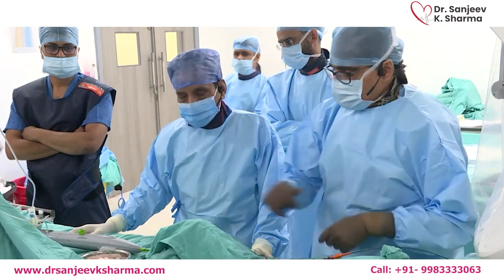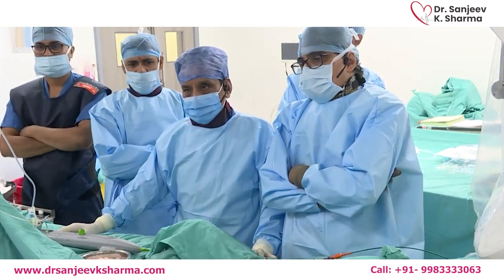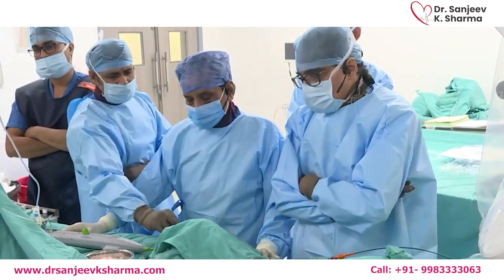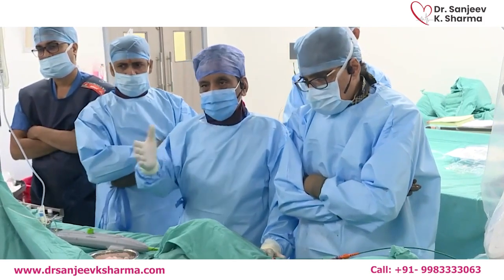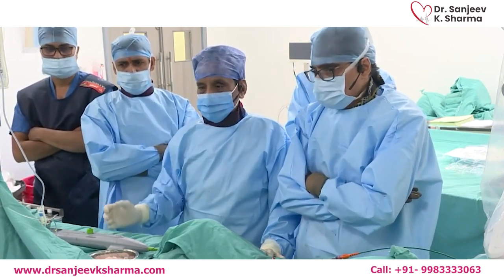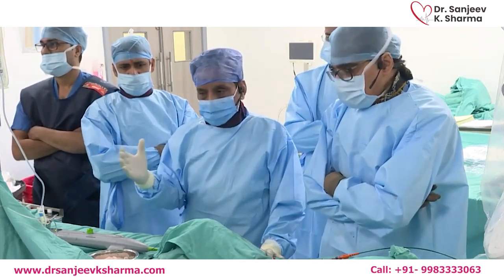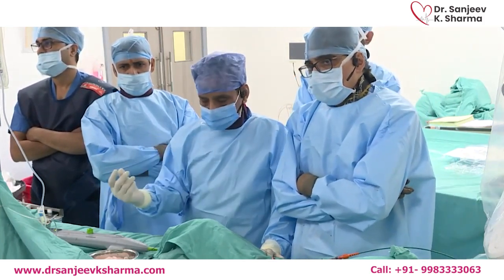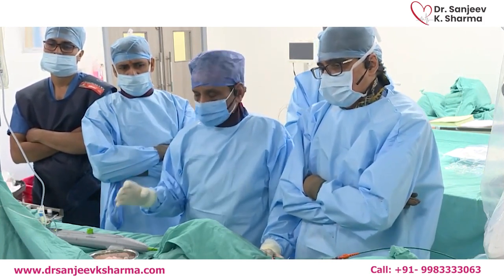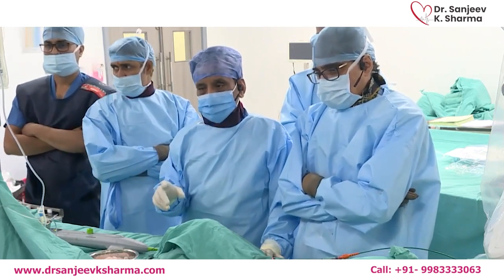I know that a lot of talk happened about IVUS versus OCT. Until we have a better agent that will not affect the kidneys, one of the big dichotomies is that anybody with a high creatinine like this particular patient, with a GFR less than 40, will go with IVUS. Some people say you can do a little injection with a guideliner and then put an OCT through it, but still some contrast will be used. So in this case, we decided to use IVUS, and we are going to show you that IVUS picture.